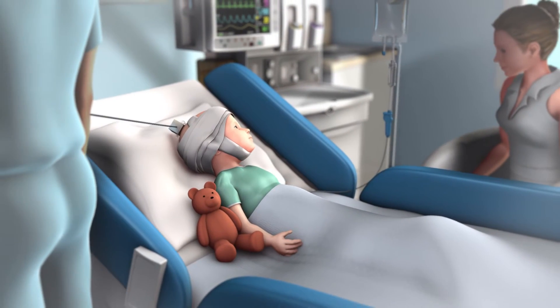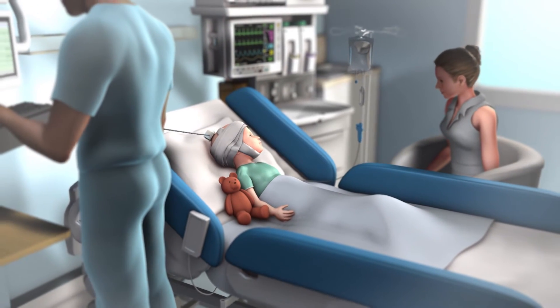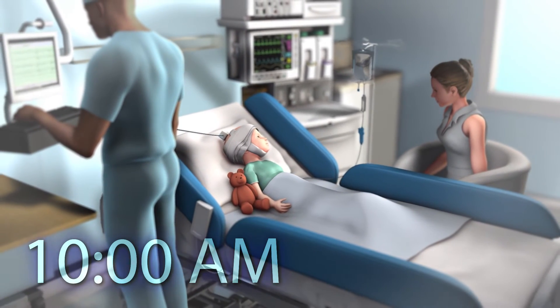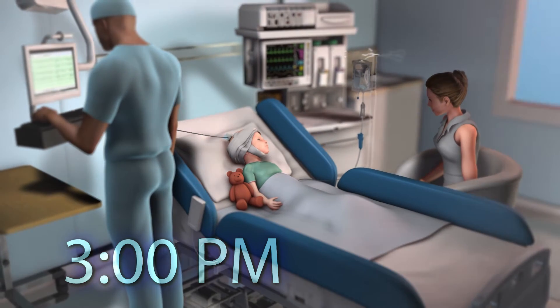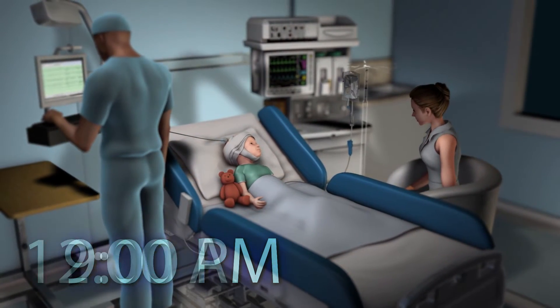After the procedure, the child will stay in the hospital connected to a video EEG. Over the next 3 to 10 days, the seizure activity in the brain will be monitored 24 hours a day.